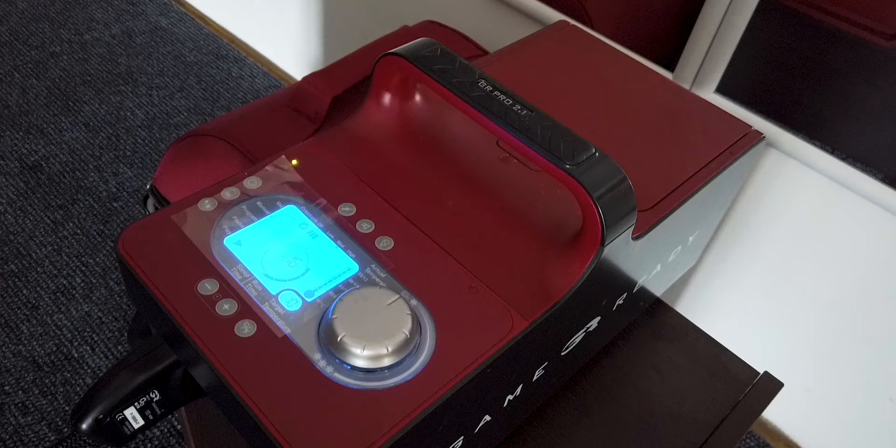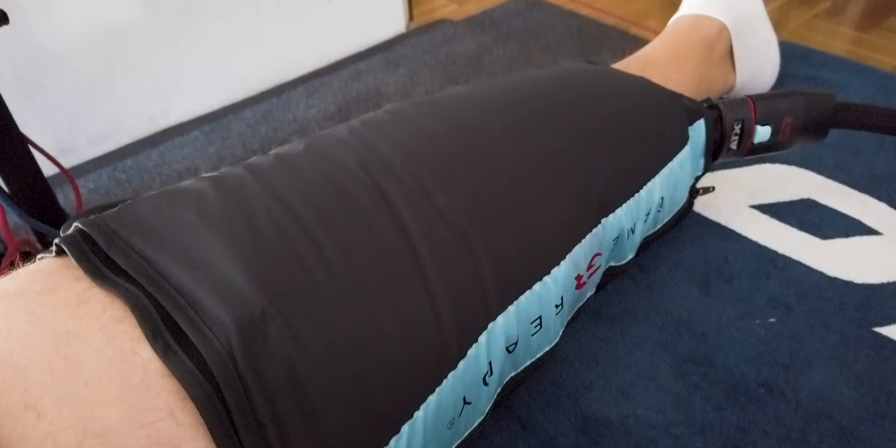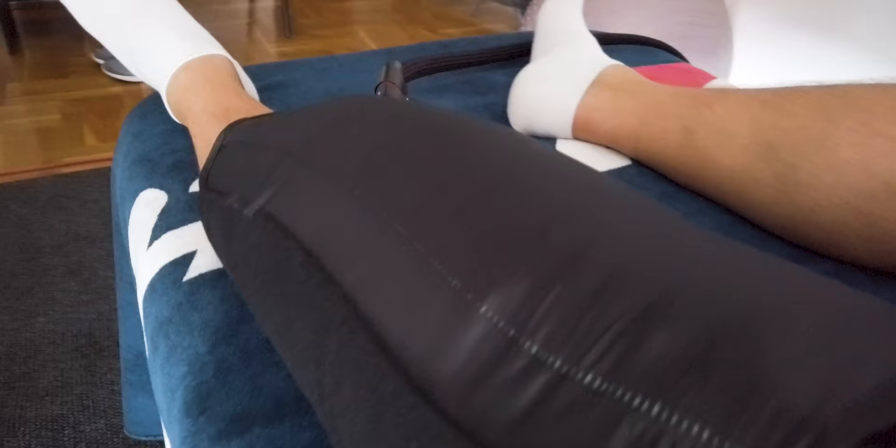So that red container thing with the blue light is the actual machine — the motor with the ice water in it. And the water travels through this tube that goes into the sleeve that's on my leg. It feels good. If you've ever had your blood pressure taken with one of those sleeves on your arm, it feels exactly like that.